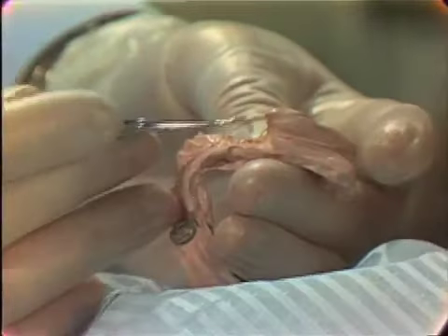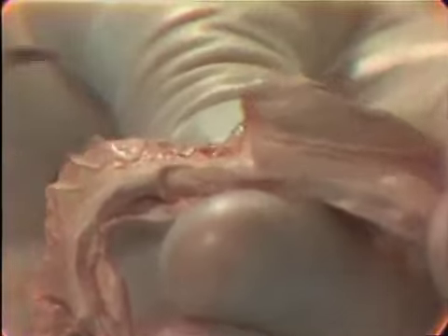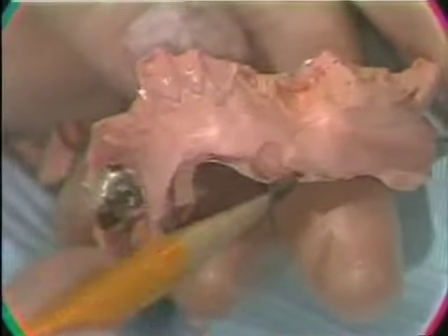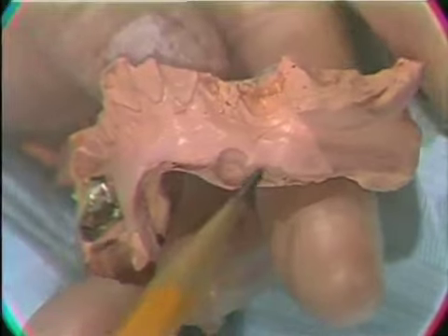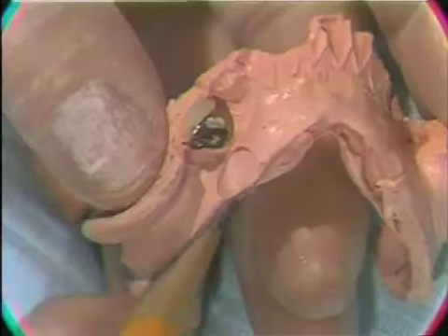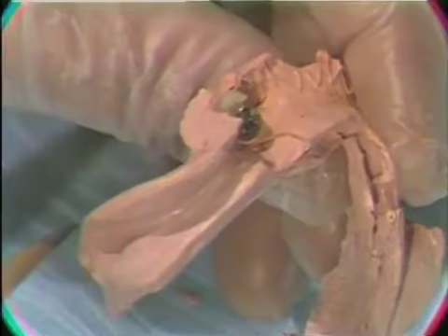We would like this area around the necks of the teeth so we can tell where to end our base casting. And we've picked up the necks of the teeth so we can tell where to position the lingual bar. We have a little void in the periphery area here of the lingual surface of the tongue. We have a large void over here that we didn't get enough material in that area to record the impression. This is a good impression of this peripheral area.